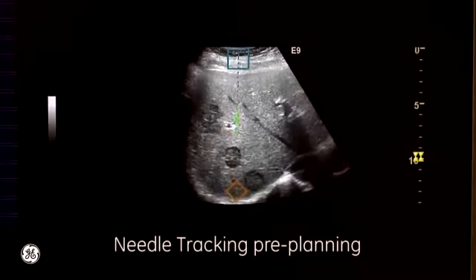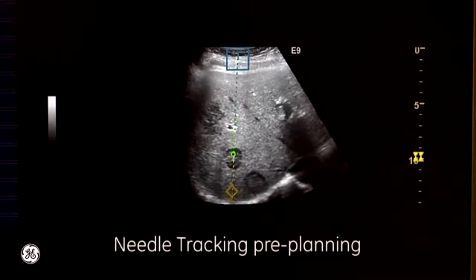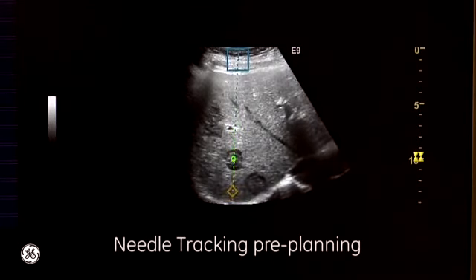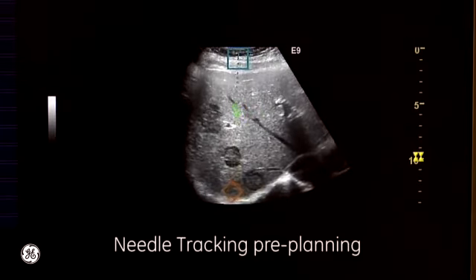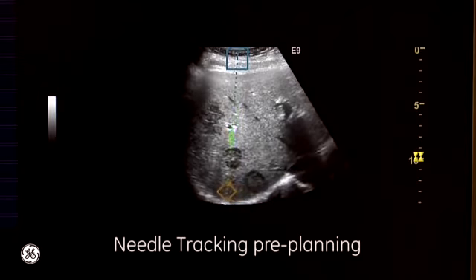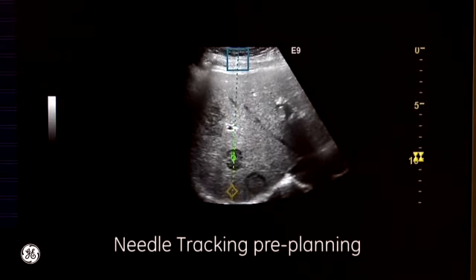Now I'd like to show you another innovative feature of volume navigation, needle tracking. In this first image of needle tracking, we are seeing the pre-planning being done. As the needle is changing orientation, you can see the graphic moving around. Our goal here now is to center the circle over the lesion of interest.